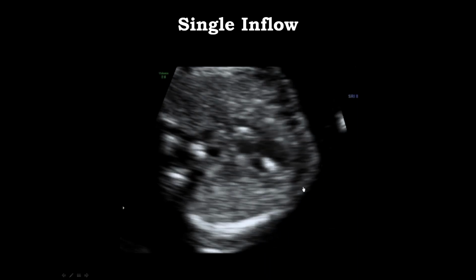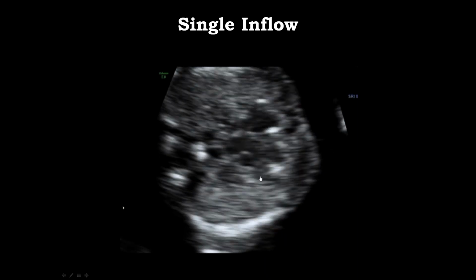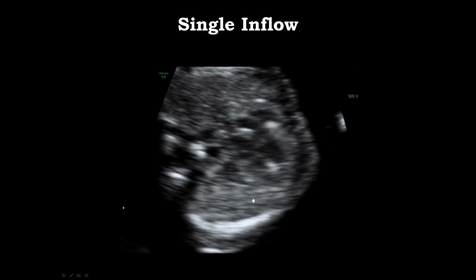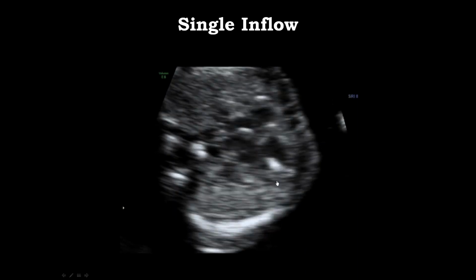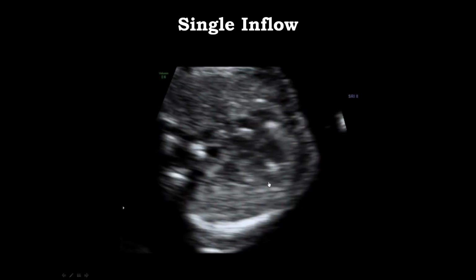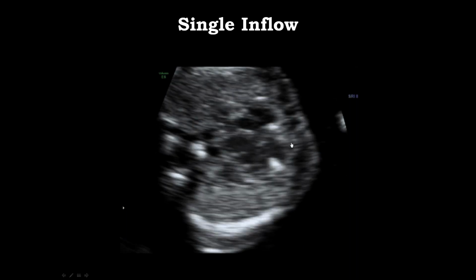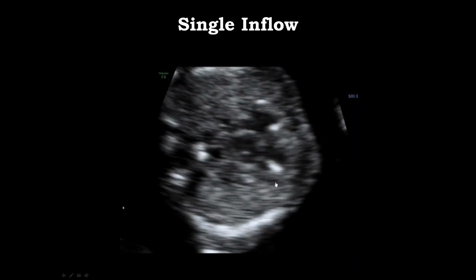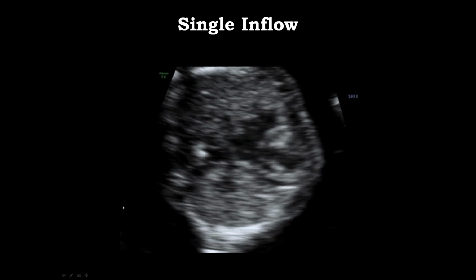So the situation where you can't measure the cardiac axis is clinically very significant. If you suspect that you may be dealing with a univentricular heart, you know that complete repair for those cases is not really possible. So this is a situation that needs to be handled very early, and you should probably consult the specialists for appropriate decision making by the family.